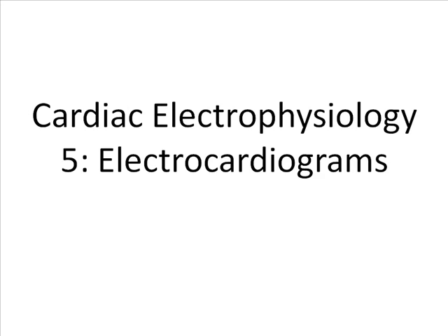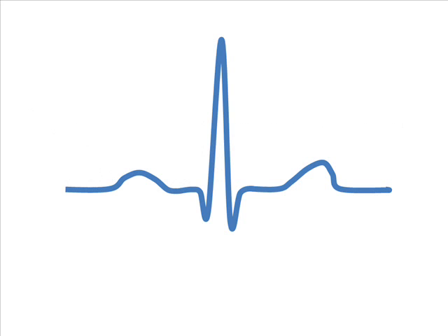So let's just start by looking at an EKG, which is the tracing of all electrical activity in the heart. It's not really following a single action potential so much as it is following the spread of APs through the heart as the AP originates at the SA node and then it propagates throughout the conducting system. So on the left, we have the first waveform called the P wave, which is the portion of the EKG that represents onset of atrial depolarization. This is where atrial contraction should begin.